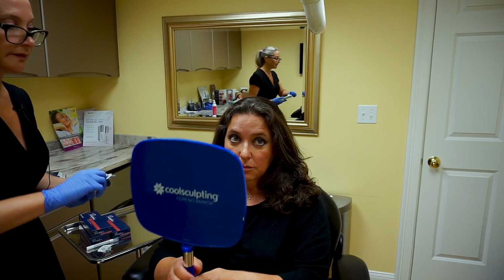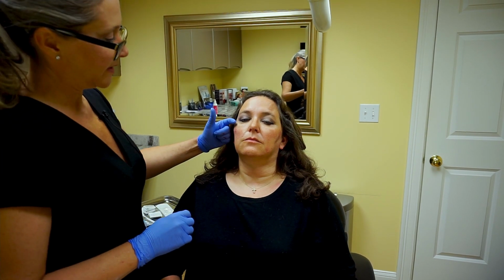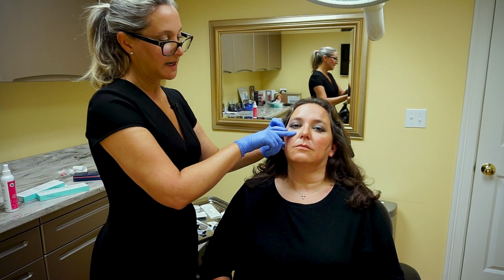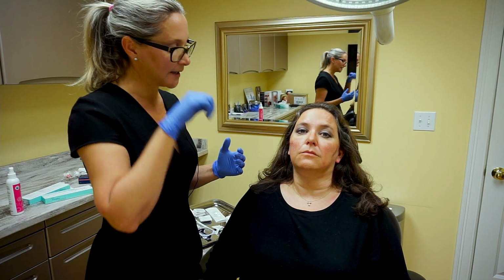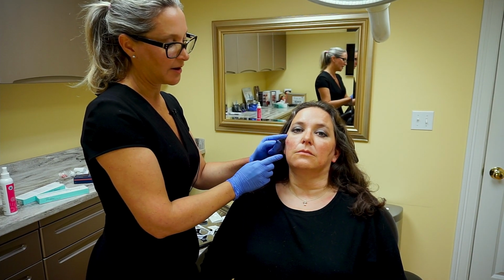See that? Look, it's nice and flattened. So right now what we've achieved is that she has some volume and some rounding of the cheek that's making her look like she has a higher cheekbone, but now we've created a look of it being a little bit flattened here. I was talking about the reference to building a house. So we've made the scaffolding here, which is kind of lifting up on the jowl area.